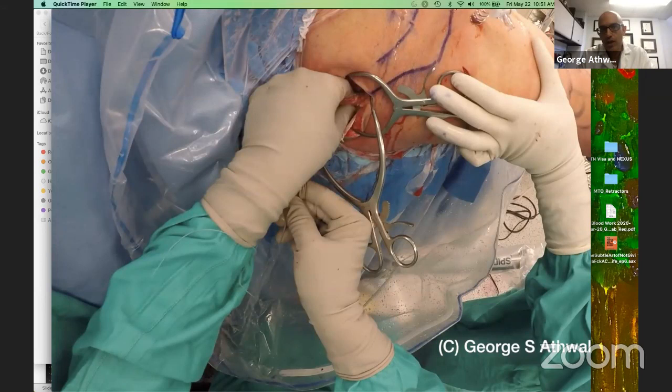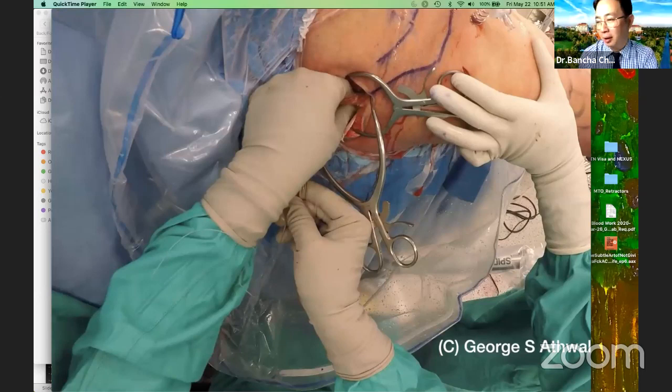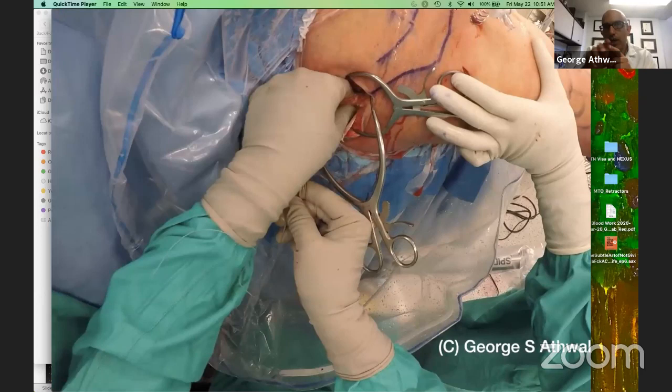George, I'm concerned about the angle because your graft comes this way and your tunnel is nearly perpendicular. When you pull the graft back, that's an acute angle. Your graft is really thin most of the time, sometimes in women, and you can pull and cut through the graft because of this acute angle. Do you have concern about that? It's not a 90 degree angle. It's a little bit more oblique because the tunnel is coming out.